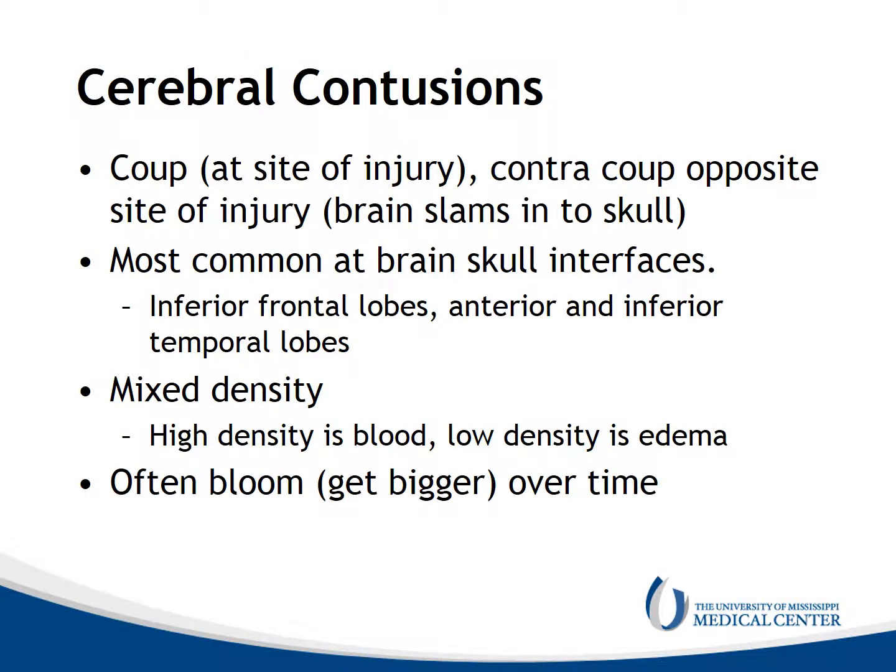Cerebral contusions occur in trauma. They may be coup at the site of injury or contrecoup where they're opposite the site of injury — that's where the brain slams into the skull. Usually they're at the brain-skull interfaces, inferior frontal lobes, anterior and inferior temporal lobes. The contusions may be of mixed density: the high density is the blood, the low density is the edema, and they often get bigger over time.